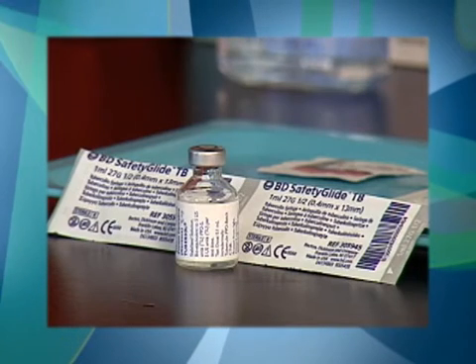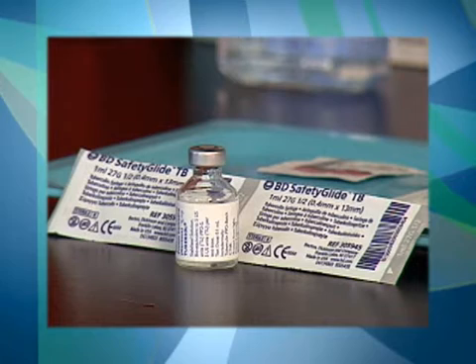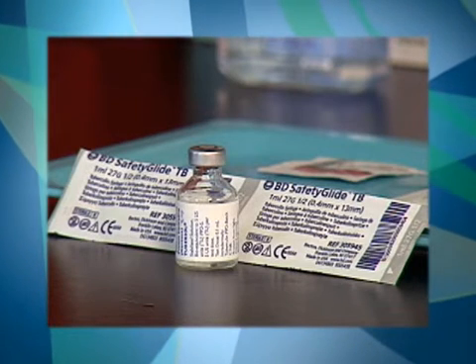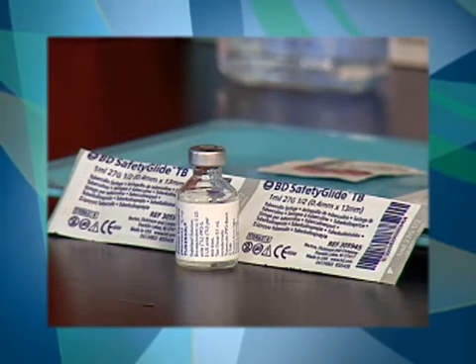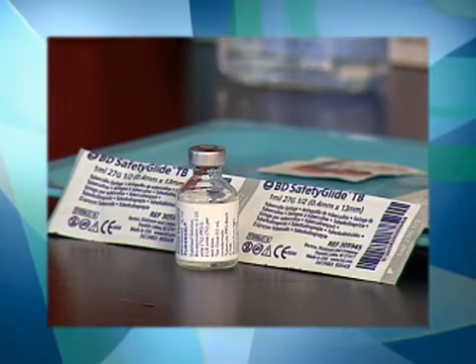The needle used for an intradermal injection is short and ranges from 3/8 of an inch to 5/8 of an inch long. The lumen of the needle has a small diameter with a gauge ranging between 25 and 27.